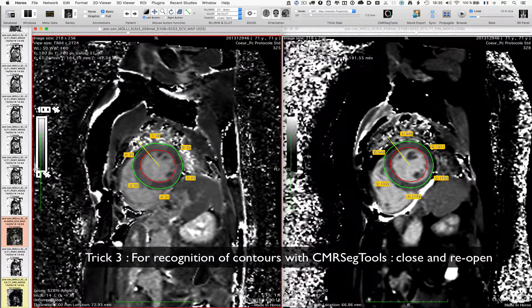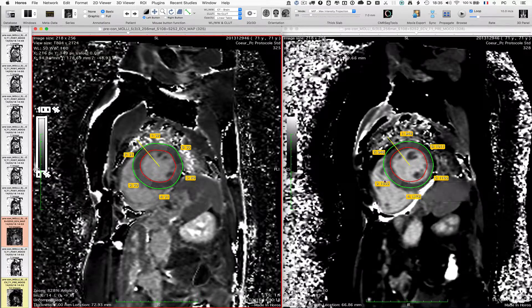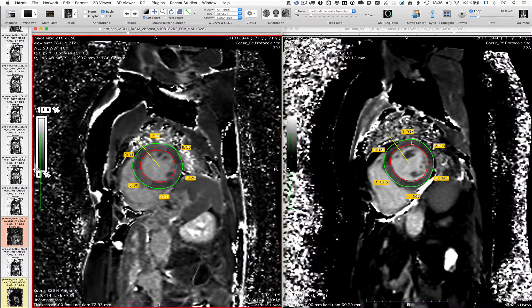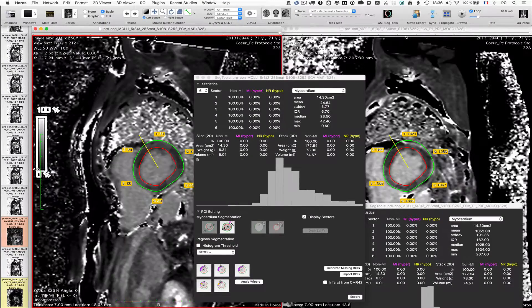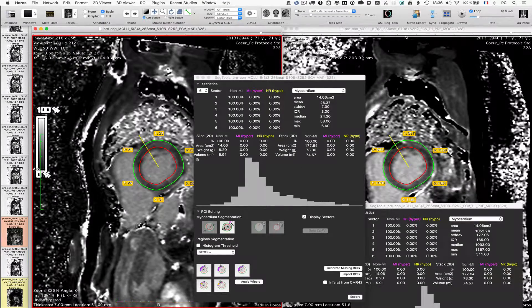And then you can see that you have a T1 value. I hope you will enjoy these time-saving features to do your research. Thank you for your attention.